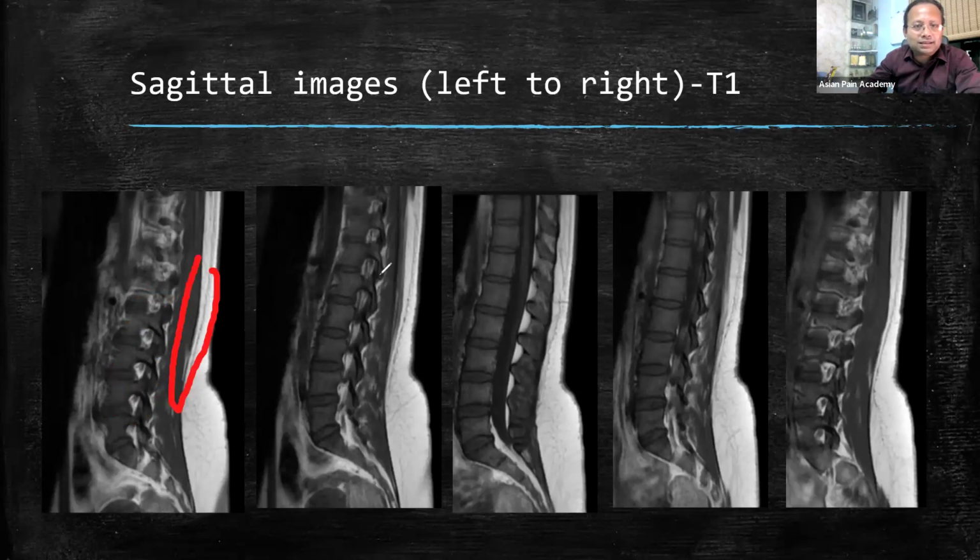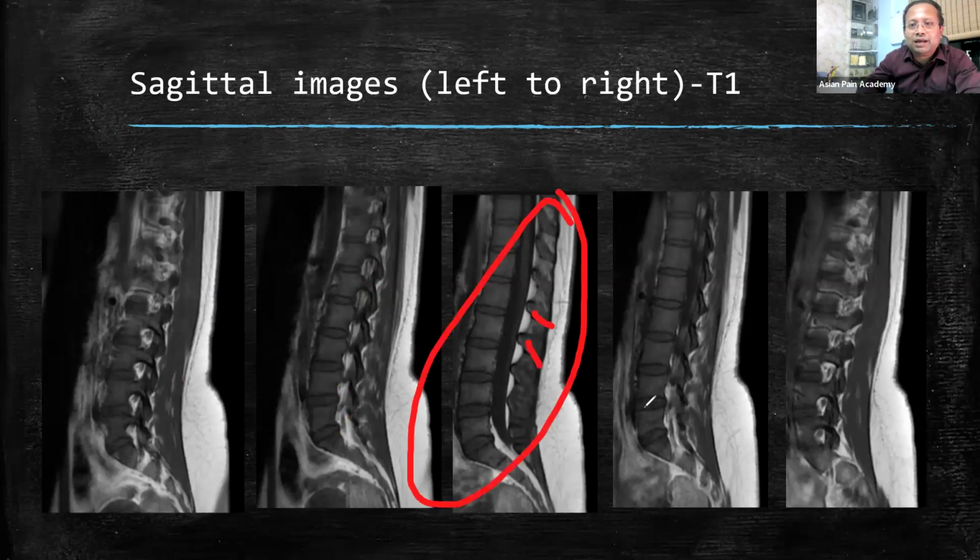This is the pedicle level or articular process. You can see this is the superior articular or inferior articular process. So you know that you are just in these areas, just medial to the pedicle, so you are just on the superior articular or inferior articular process. By seeing the bone, it is the midline. You can see clearly the spinous processes. So you are at the midline.